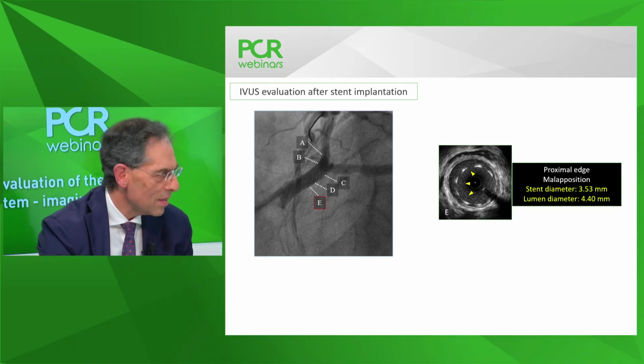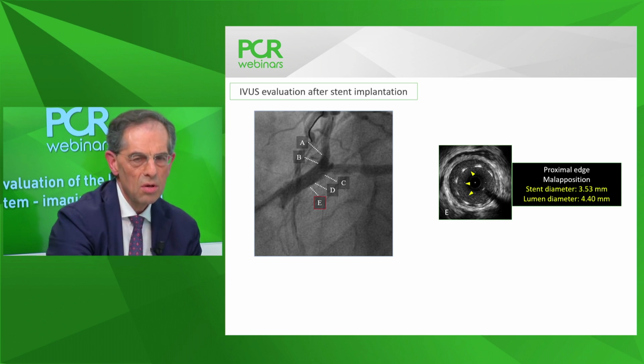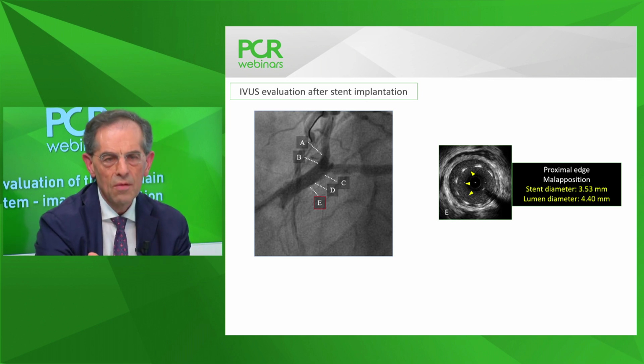So we needed to take into account both, and probably be especially focused on the distal to avoid dissection. They decided to go with a last generation stent that can be gently overexpanded compared to the original size. And now we have the evidence not only of the use of IVUS before the stent implantation, but how to use the IVUS at the end of the implant.